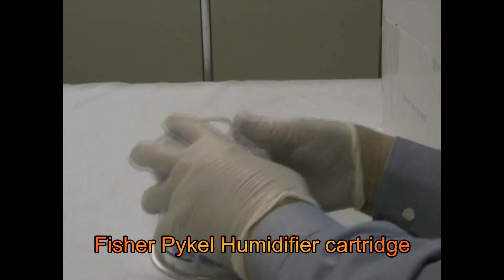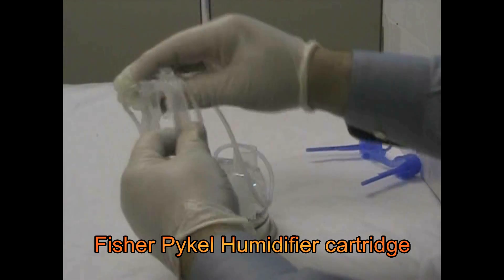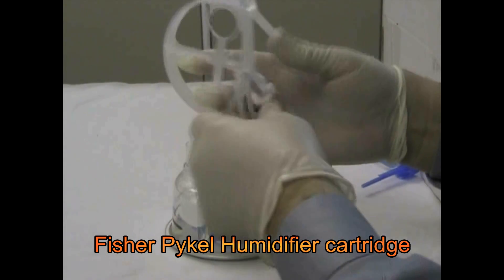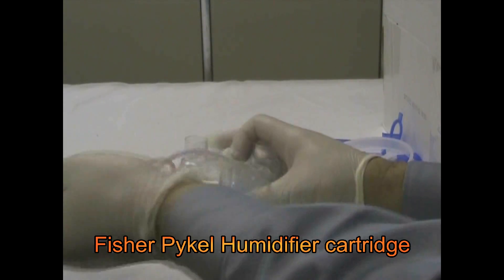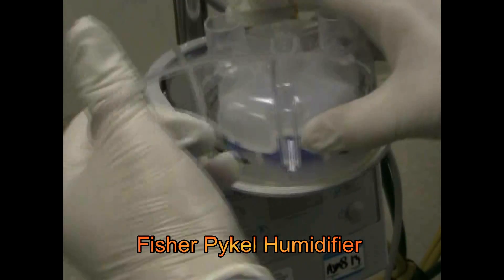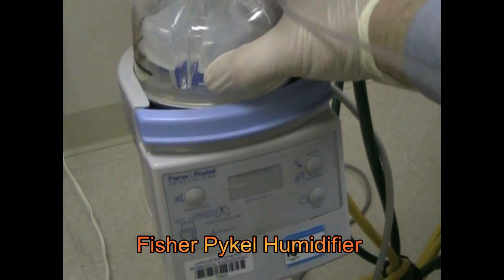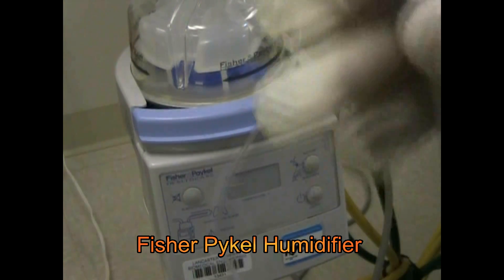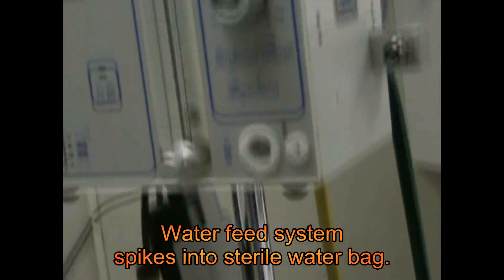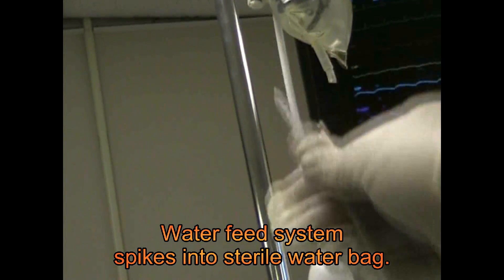To start with, let's open up our humidifier. This is what we're going to be using for humidity — it's a Fischer Fiekel heated humidifier. I'm just going to put this right here, push down to latch in, and then this spike is going to go into my bag up here and spike right into the bottom of that when I'm ready.